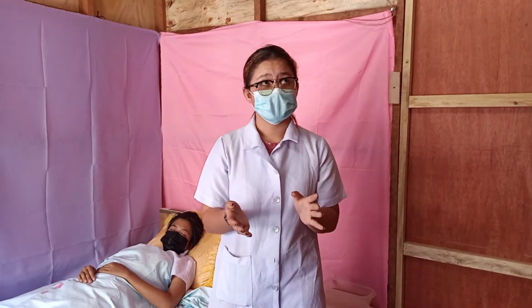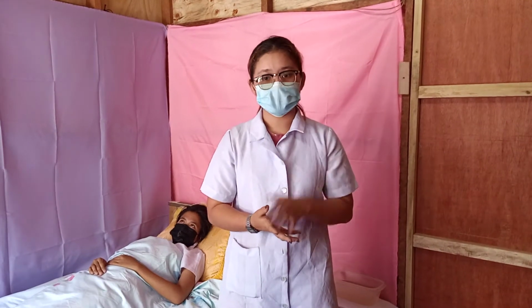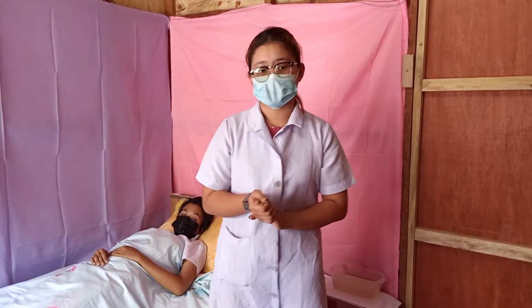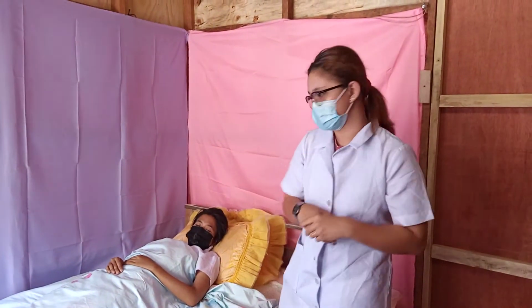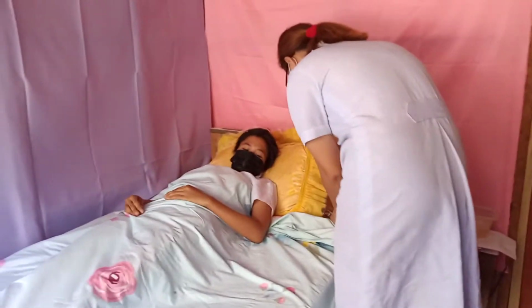Having the arm above the level of the heart causes a decrease in BP. So, ma'am, upo po tayo, ma'am.